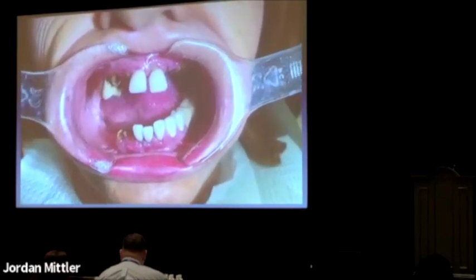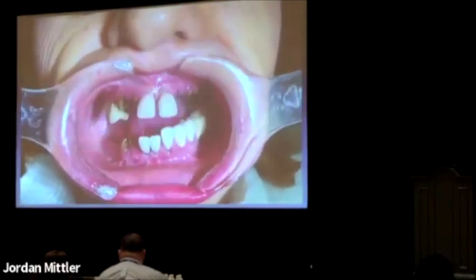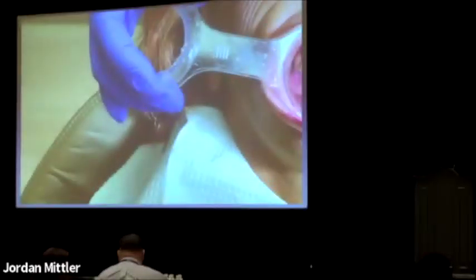It's just replaying the video to remind you where she started. You really have almost no choice but immediate dentures here. Again, could do immediate placement, but a lot of infection, not my first choice.